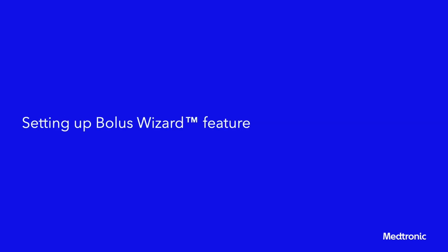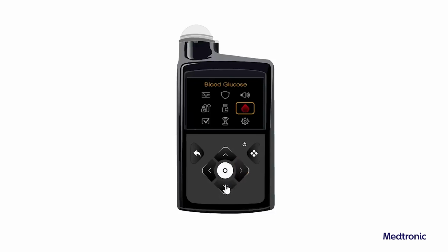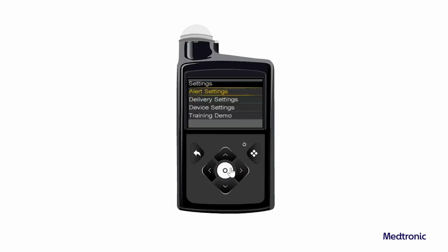Setting up the Bolus Wizard feature. To use the Bolus Wizard feature to calculate a bolus, first turn on the Bolus Wizard feature and enter the Bolus Wizard settings. To set up the Bolus Wizard feature, from the home screen, press Select, and then select Settings. Select Delivery Settings, and then select Bolus Wizard Setup.